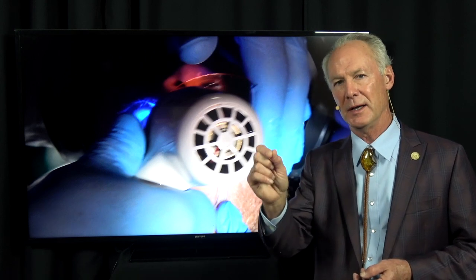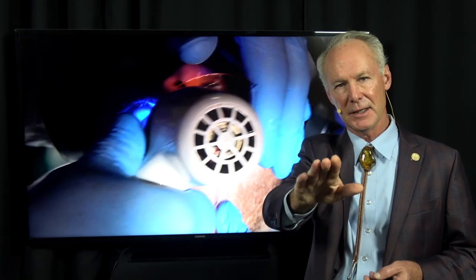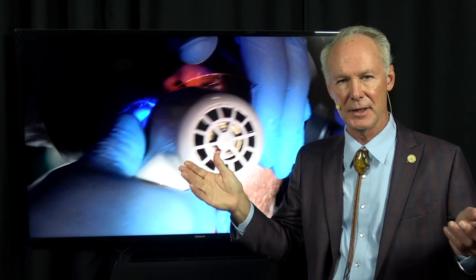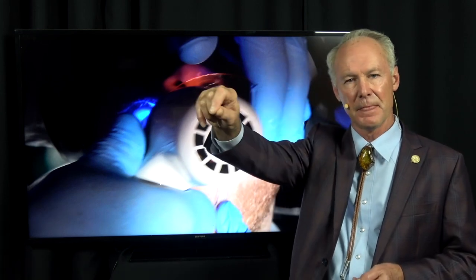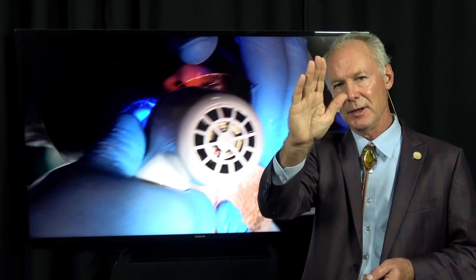So if you wipe away that excess cement before it has initially set, and this is very important, so that it breaks off or peels off and doesn't wipe off, you're going to get some suck back in that micro gap, and you're going to have a void in the micro gap. Well, bacteria can get into that void and cause sensitivity, staining, gingival irritation, all those things. Whereas if you peel off the excess or polish it off, you've got a solid space like a sandwich between the veneer and the restoration. So bottom line, don't wipe off the excess luting composite. Peel it off or polish it off.